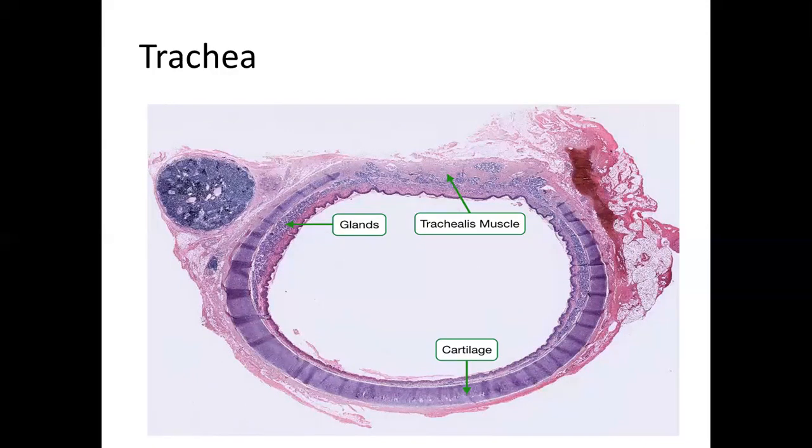Okay. And it has a subepithelial connective tissue, the lamina propria. Okay.